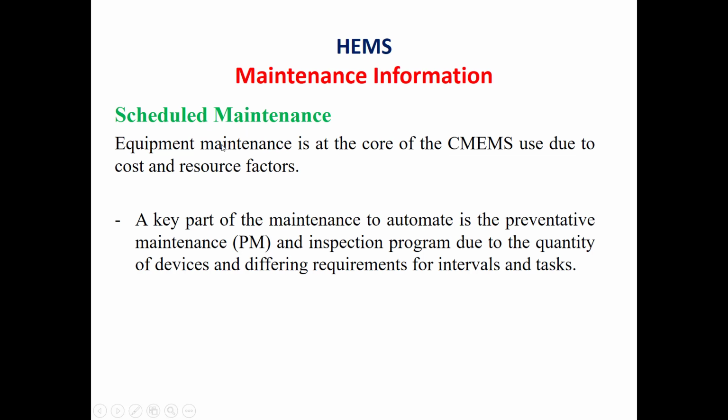The scheduled maintenance is at the core of the computerized medical equipment management system use due to the cost and resource factors. A key part of the maintenance is to automate the preventive maintenance and inspection program due to the large number or the quantity of medical devices and the differing requirements for intervals and tasks.